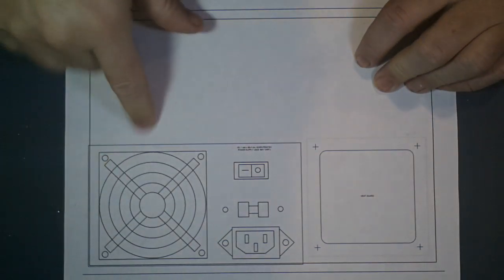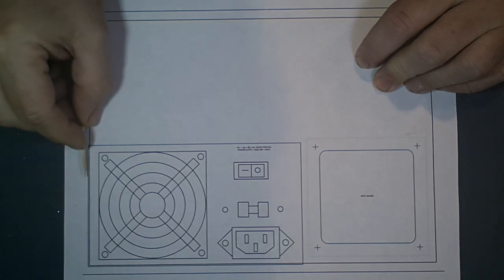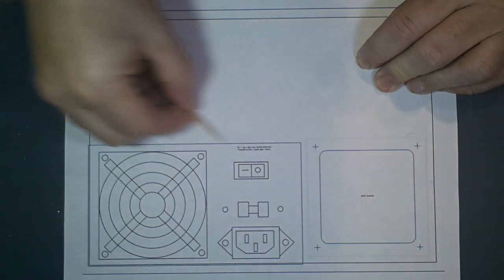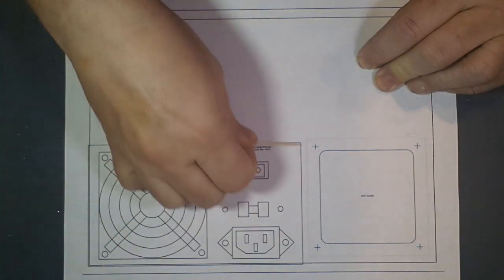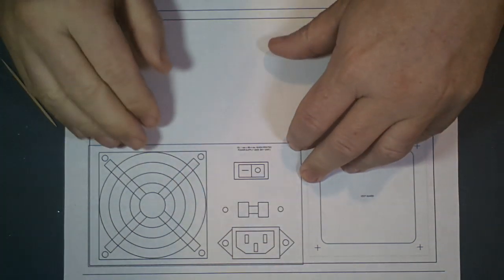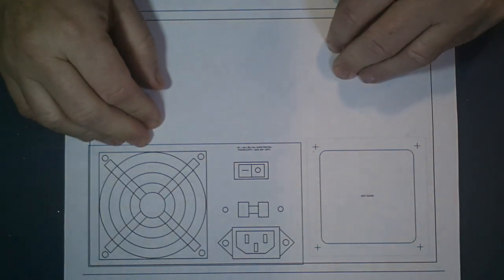And this is just an outline of the power supply. You can see I have a little bit of offset here. This is in case my notches aren't the right size. When I cut this out, it basically offsets and makes the hole a little smaller so I can trim this and get a perfect fit, because this should be flush just sticking out the back end of the power supply. Again, I don't have drawings on that, but maybe I can give you some drawings.